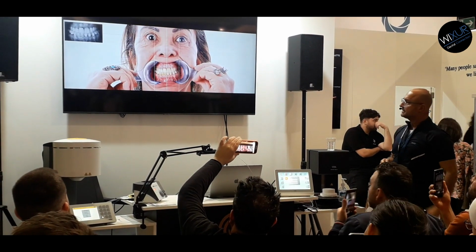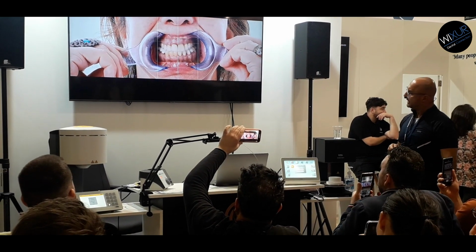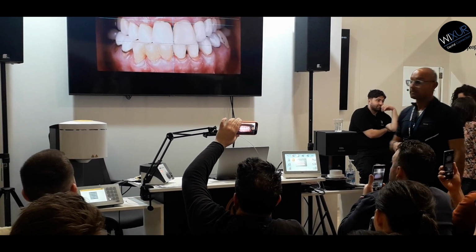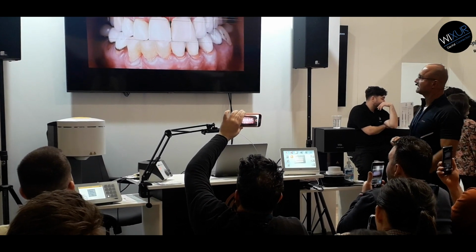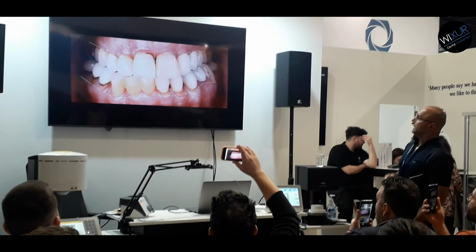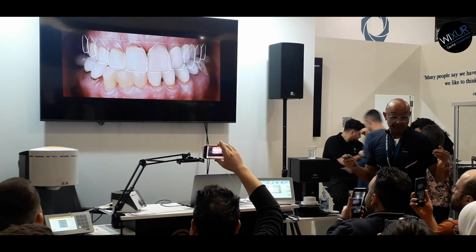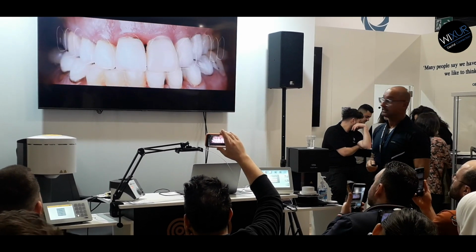Some DSD lines, intraoral pictures, projected onto the extraoral pictures. Now we don't need the face, and now we see the differences. Left side is shorter, smaller. Now we know everything, yes? It's not just guessing. We should understand it. Put the golden proportion, or Preston proportion, whatever, and we see there is no harmony, there is nothing. No symmetry, no harmony, and we can't make any orthodontic treatment, we can't open the maxilla. This is it. We have to fix it like this.